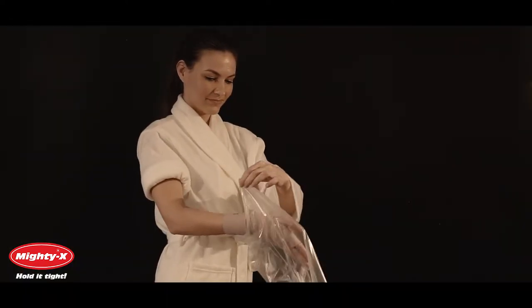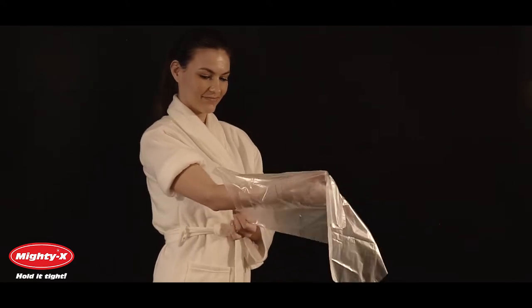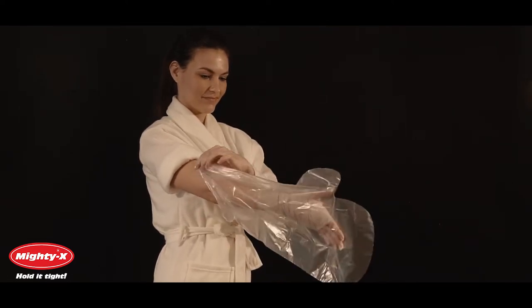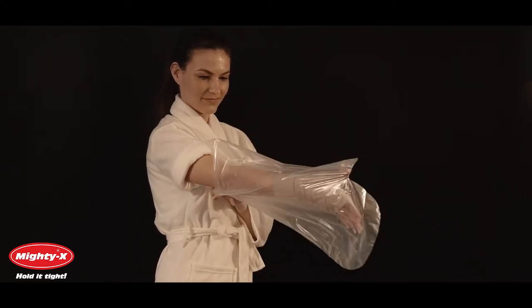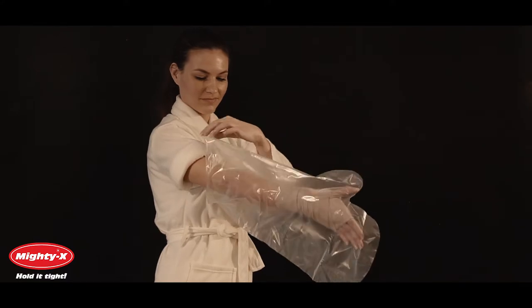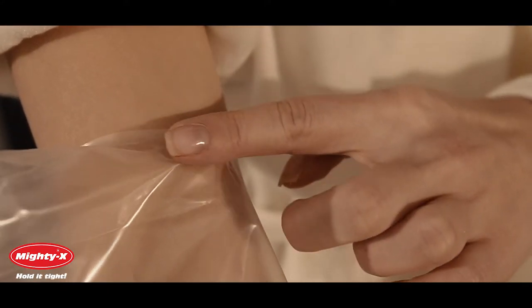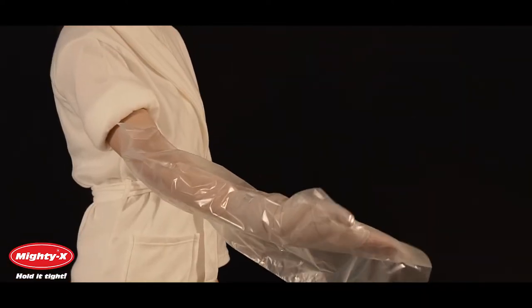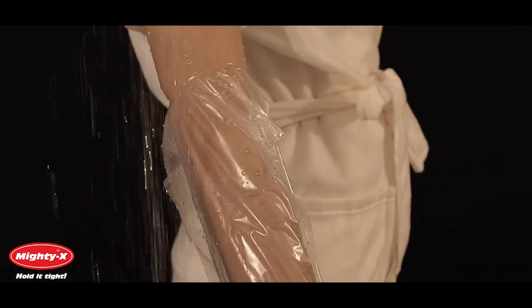Carefully pull the cover up by the corners as high as it will go up on your arm. Be sure to use uniform tension on its corners when putting it on. Smoothing the seal all the way around creates a plastic band that should be visible on your skin. Pull back down slightly to complete the seal. Make sure that your cast or bandage is fully covered and the seal fits snugly on your skin. You are now ready to shower.